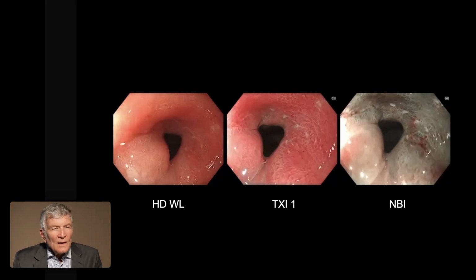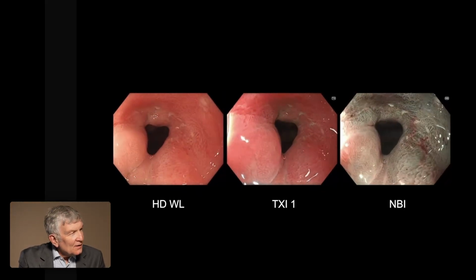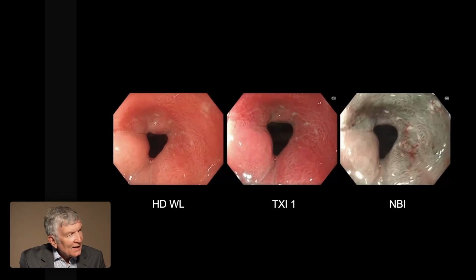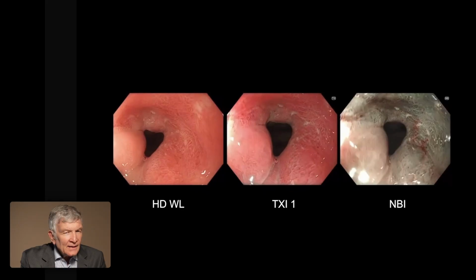The left side, Stefan, is what? It's the new generation? Left side is new generation, yes. No TXI. And in the middle we have TXI. Middle is TXI.